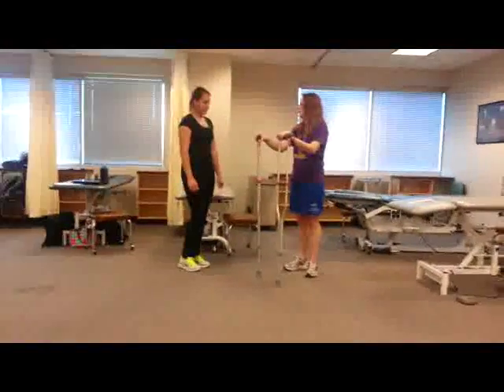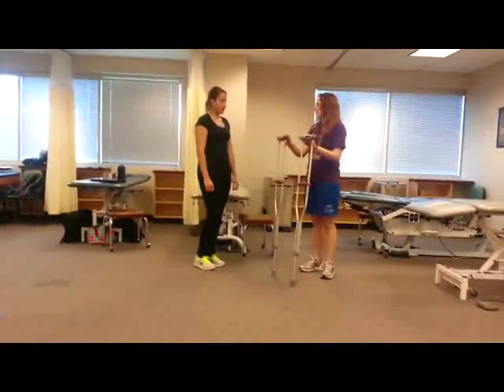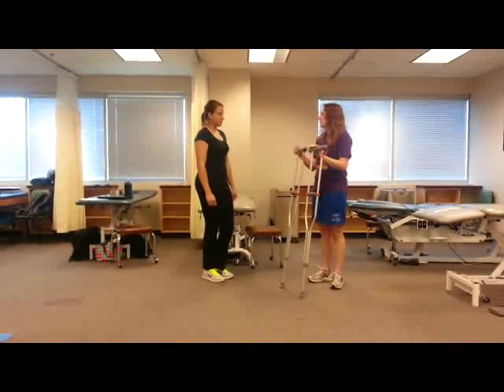So today I'm going to teach you a little bit more about how we work with patients. I'm going to teach you how to get crutches ready for a patient to be able to use them, and then teach you a few gait patterns that you might use with a patient, so you might be responsible for teaching that to them.